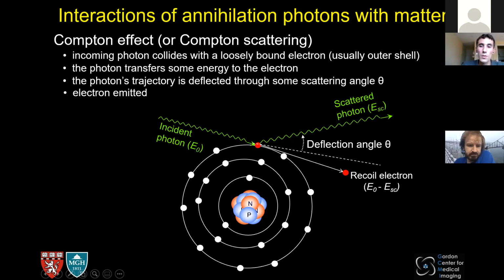So typically we are going to try to correct for scattering in PETs as much as possible because we don't want those photons to contribute to our signal. So not so good, Compton scattering. We want to get rid of those. And you'll see that with George on Thursday's lecture, how we correct for scatters.